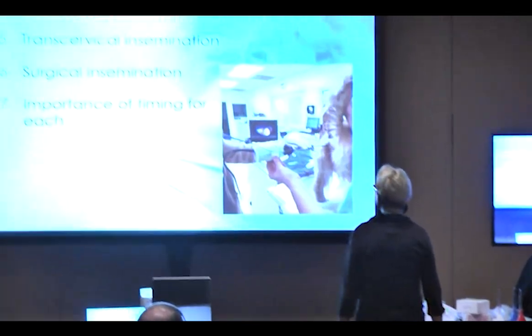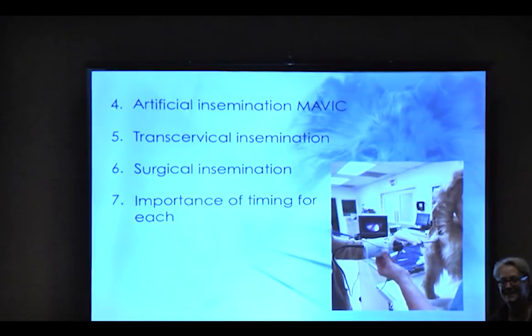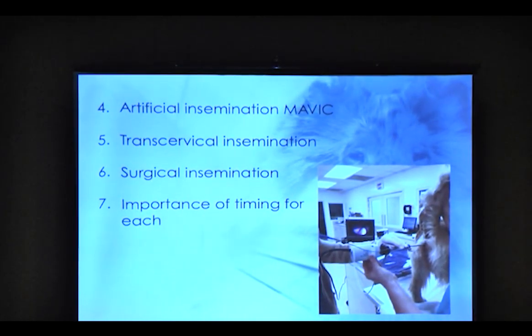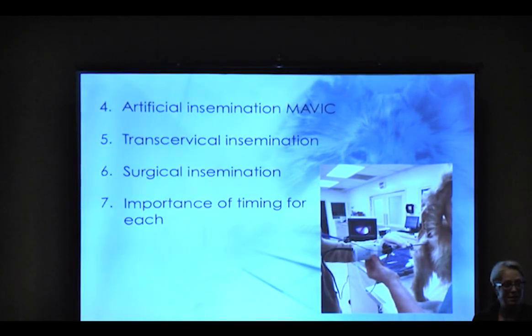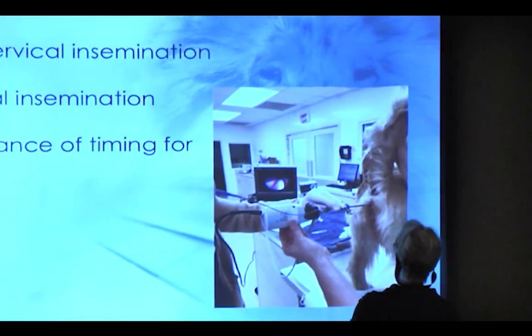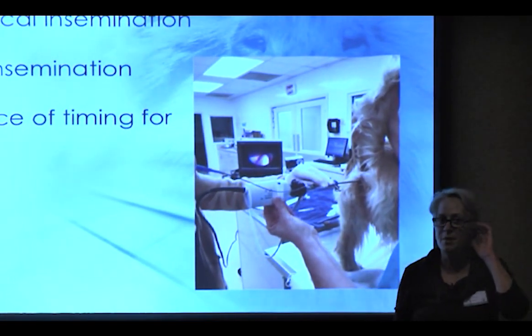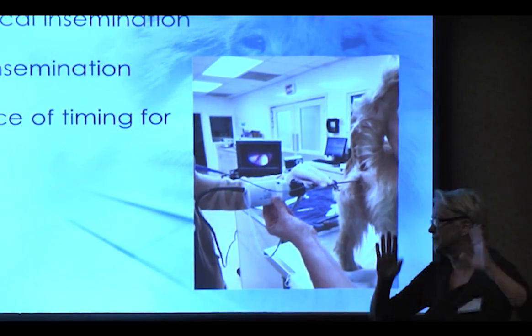Okay, let's see what else. Oh, artificial insemination. This is what I love to do too. This is transcervical insemination. How many of you have seen this? All right. This is transcervical insemination. This is a golden retriever bitch. I don't even know why we inseminate them, because you put the sperm on one side of the room and your dog on the other side, right?